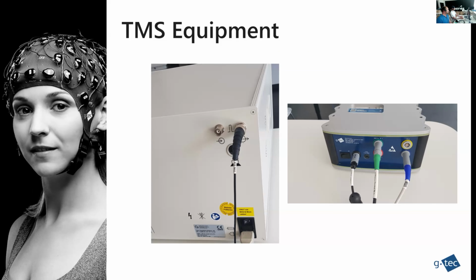What we are doing now is we connect on both sides a cable. On one side, because we want to trigger the stimulation. On the other side, we want to know when we get the trigger from the stimulation so that we can measure the delay. With the Stimbox, we had here around 20 milliseconds delay.